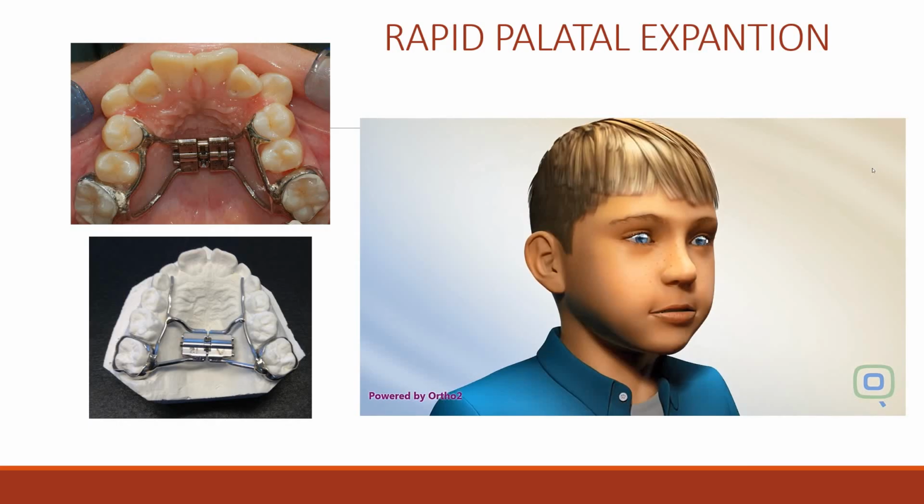Up to 10 kilograms of force can be achieved with these appliances, and initially up to 80% of the expansion achieved will be skeletal, more so anteriorly. However, in the longer term, a lot of this will relapse, with ultimately only around 50% being skeletal.